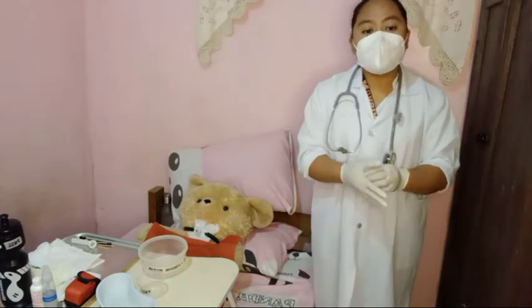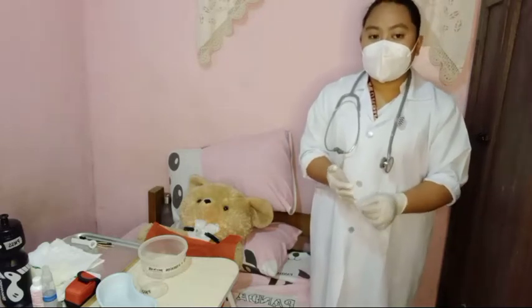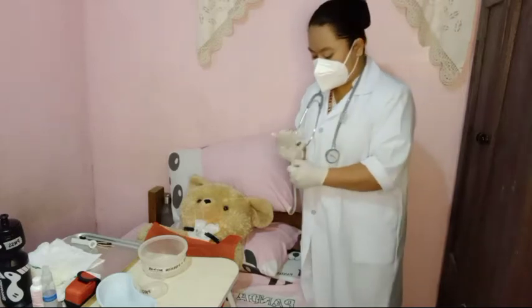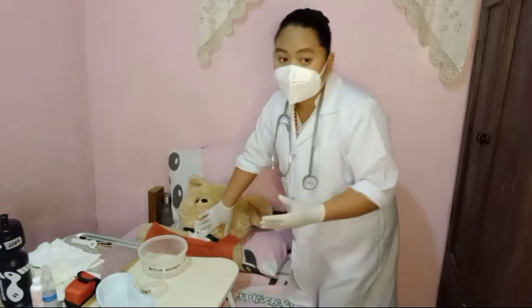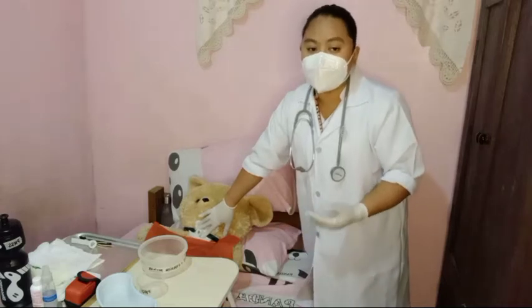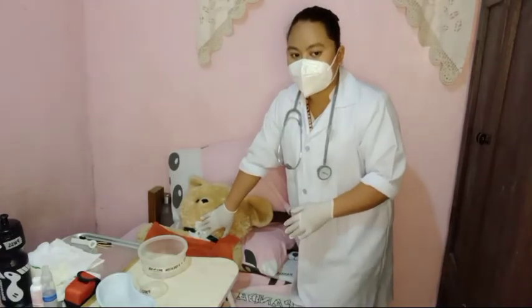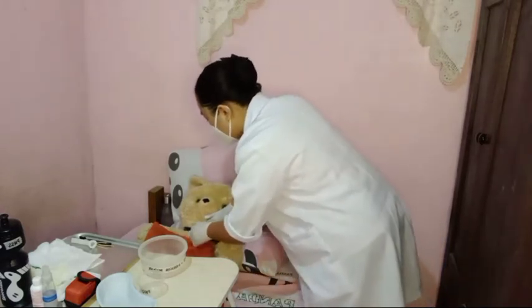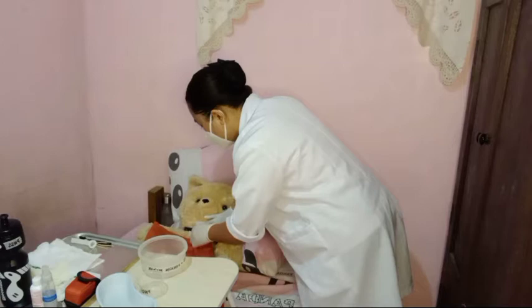And then, remove the oxygen source if one is present. Stabilize the outer cannula and face plate of the tracheostomy with your non-dominant hand. Grasp the locking mechanism of the inner cannula with your dominant hand and gently remove the inner cannula and place it in the first basin with plain NSS and hydrogen peroxide solution and let it submerge for a few minutes. So I'm going to take off the inner cannula. Deep breath. 1, 2, 3.